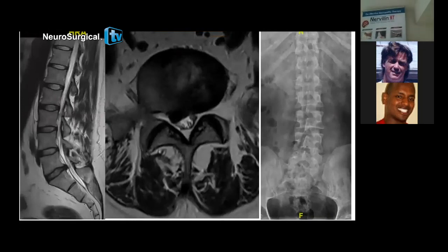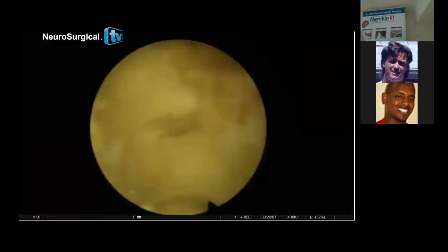And you know, maybe you think this is not a big one. But can you see the root here? Just pressing the root. I'm going to show in the video. You cannot believe. The root is like this, and this is like this. Yeah. So the patient was really painful. Look.